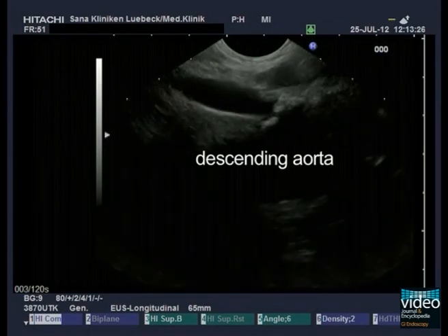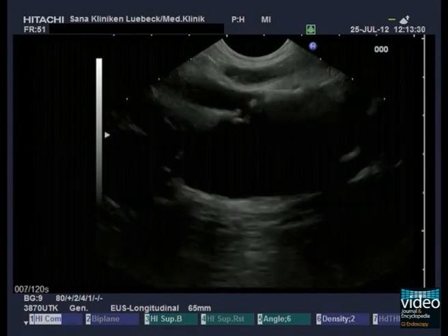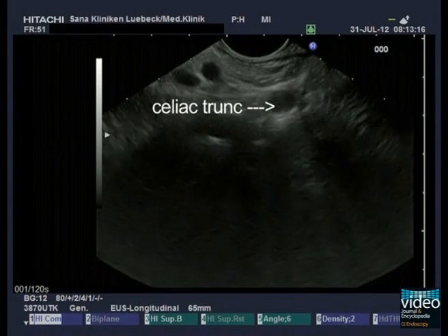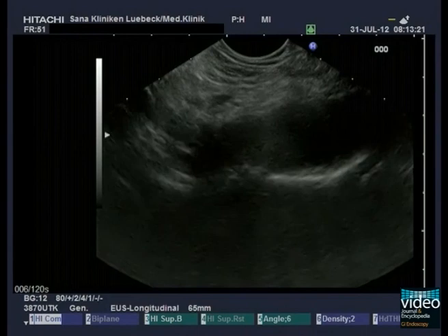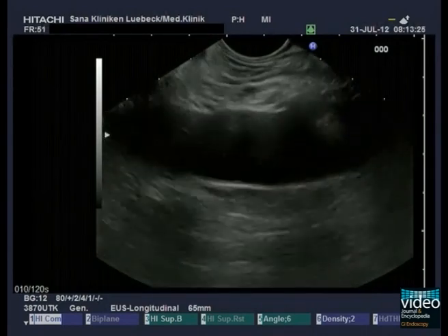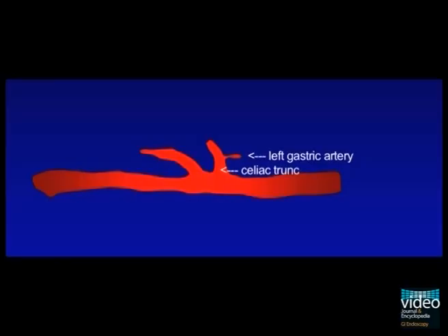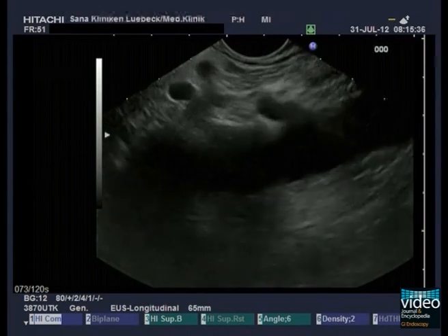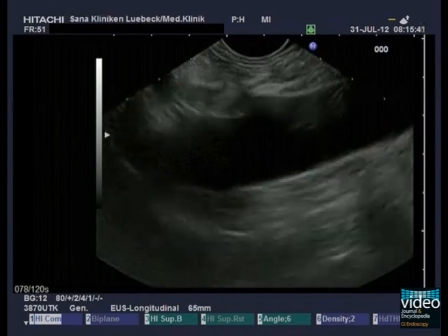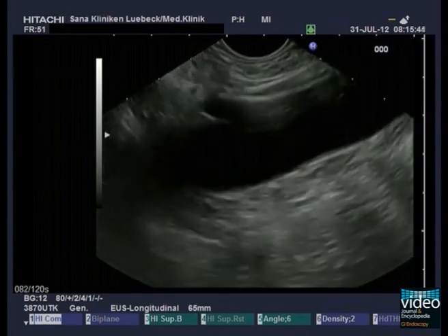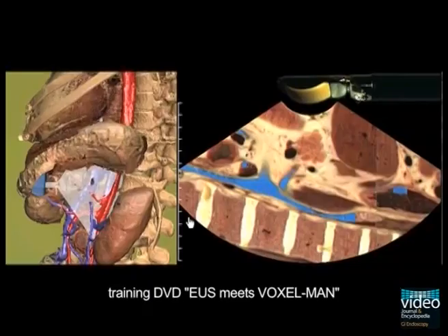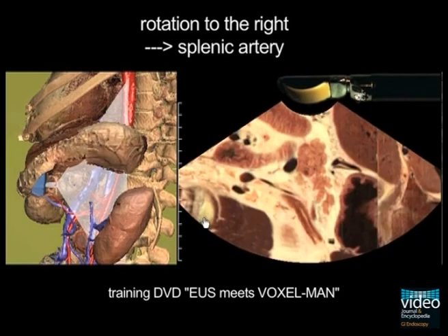Following the descending aorta, you will find step by step the vessels along the abdominal aorta. First, the celiac trunk with the common hepatic artery, splenic artery, and left gastric artery is visible. Because of the anatomical position of the celiac trunk, only the main trunk and the cranially running left gastric artery can be depicted in front of the aorta. To follow the common hepatic artery or the splenic artery, a rotation to the left or respectively to the right is needed.